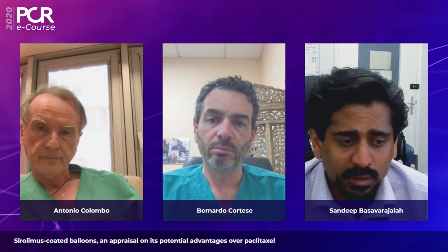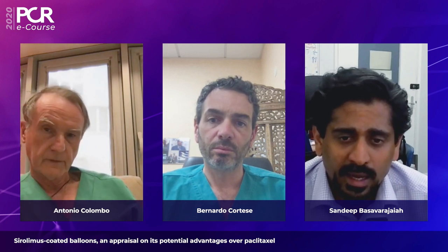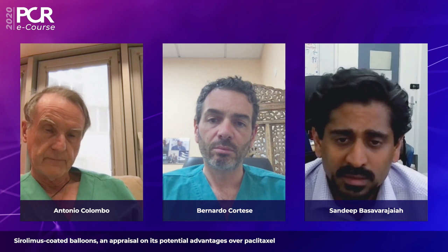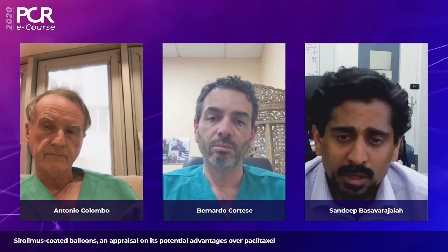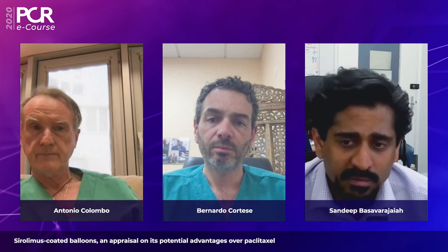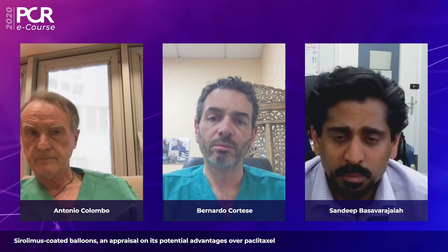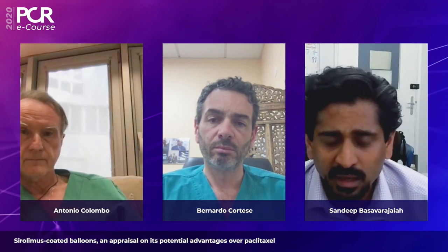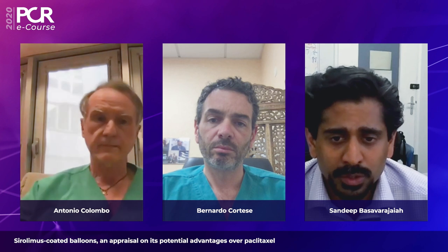I totally agree that I've not thrown out any Magic Touch balloon so far where I could not deliver within 2 minutes. Whereas Sequent Please Neo, although the best in Paclitaxel as you said, we have issues when it comes to tortuous lesions, especially when you're delivering in the distal RCA, PDA branches. Even with the guideliner, we struggle, especially if it's the long balloons you're using.